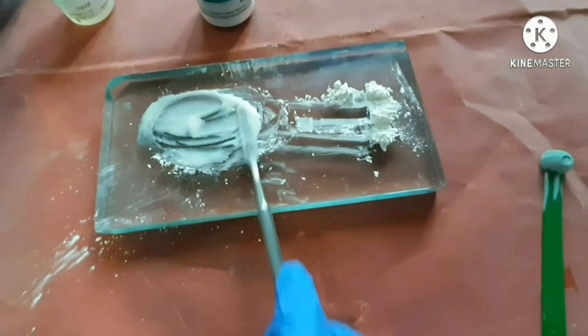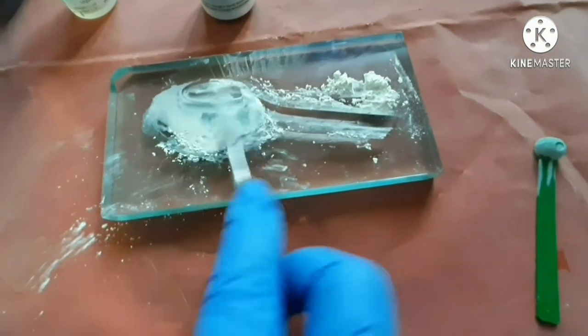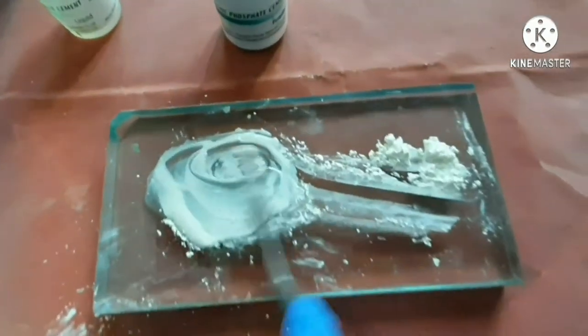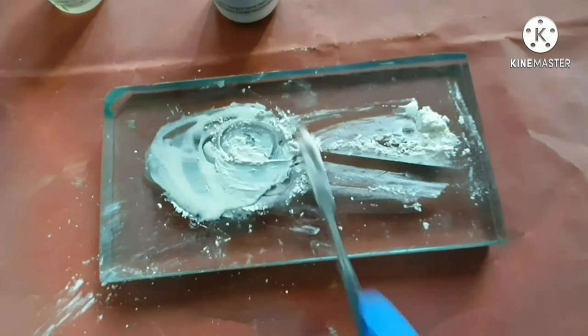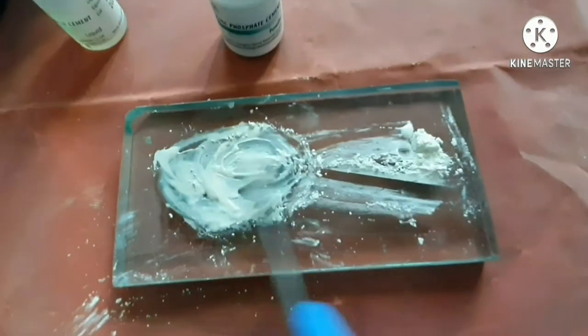The first consistency is to achieve a luting consistency that is stringy. Add the remaining powder to achieve the best consistency.